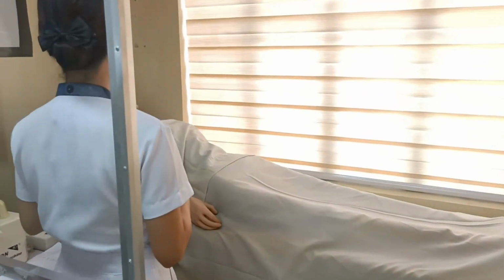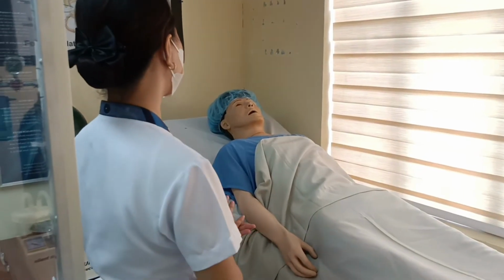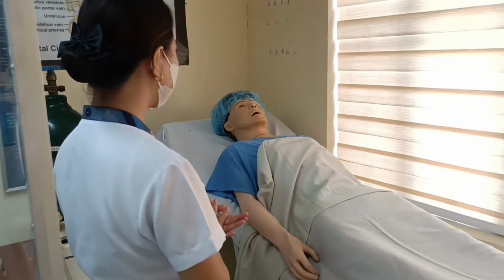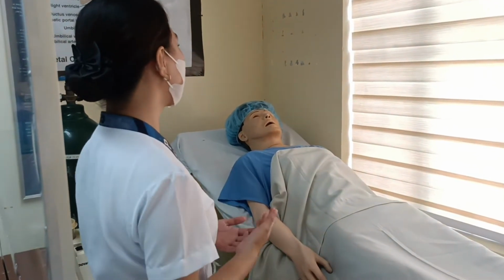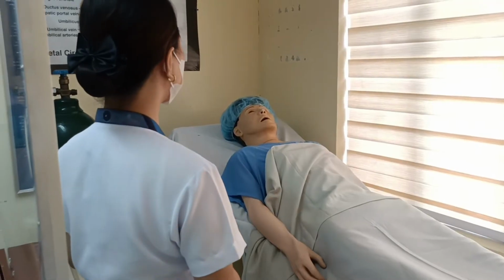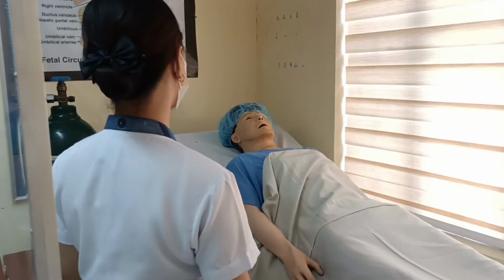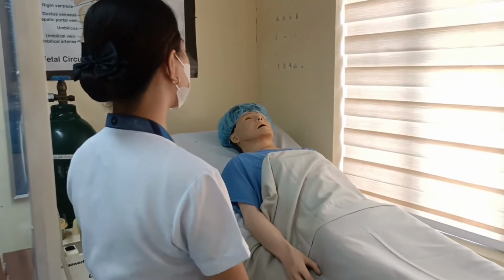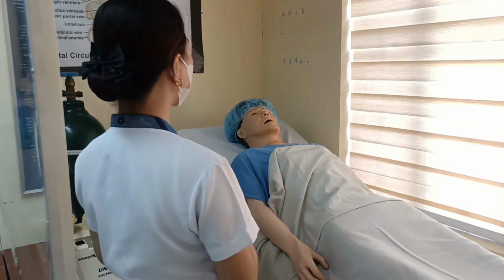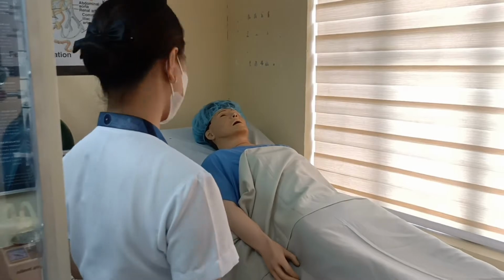Good morning, ma'am. My name is Nicole Gaspi Sasaluya. May I please verify your identity? Kindly state your complete name, age, and birthday. Okay, ma'am. So today, ma'am, I am going to perform the suctioning. The purpose of this is to reduce your secretion and to prevent the infection. This procedure, ma'am, is slightly uncomfortable but painless. So I will be needing your cooperation. Is that okay with you? Yes. Okay, thank you, ma'am.